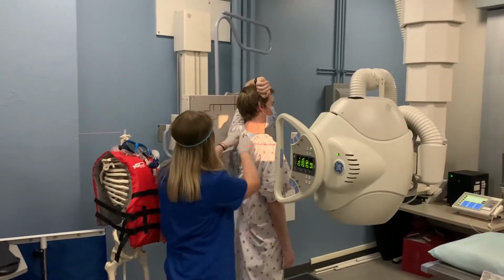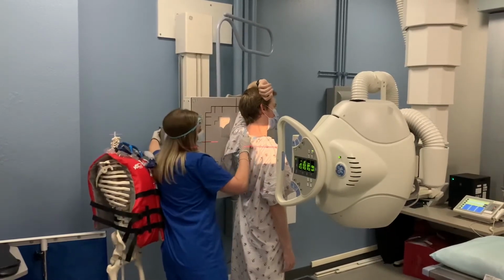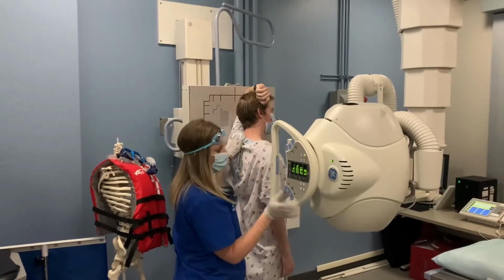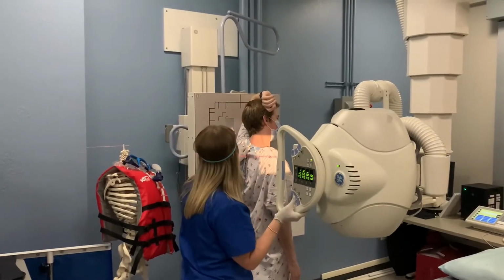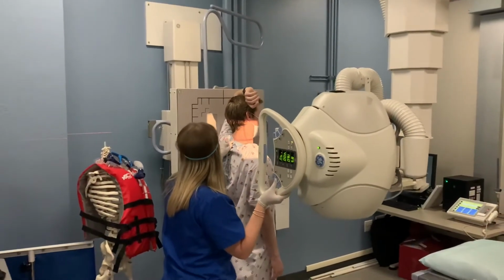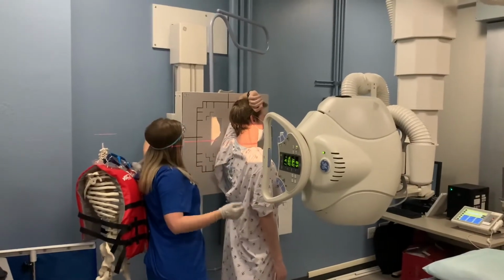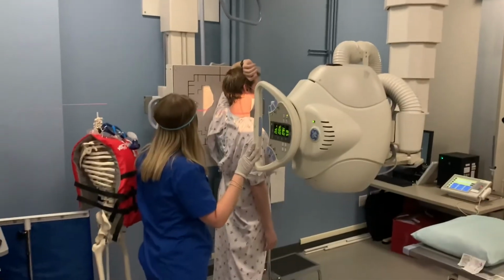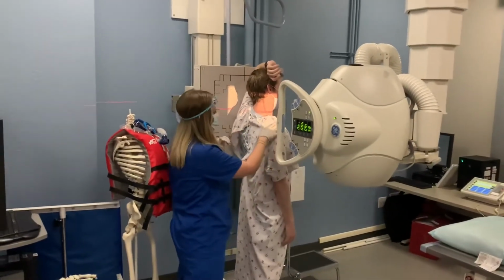So it's going to be about here. You want to make sure that your collimator light is aligned to the tube. And then from there, again, make sure the shoulder is dropped.